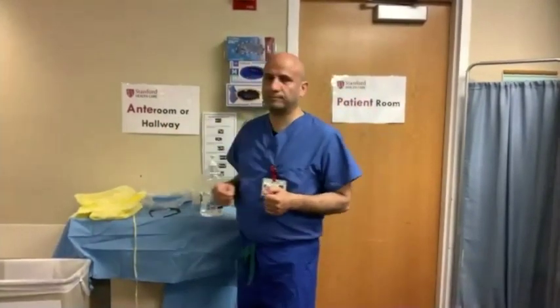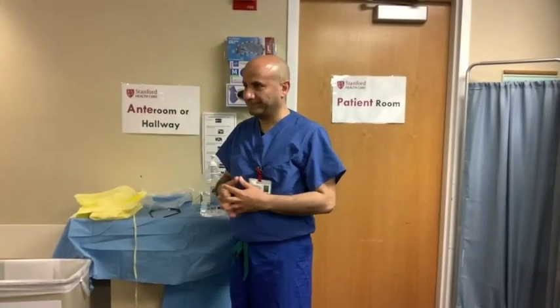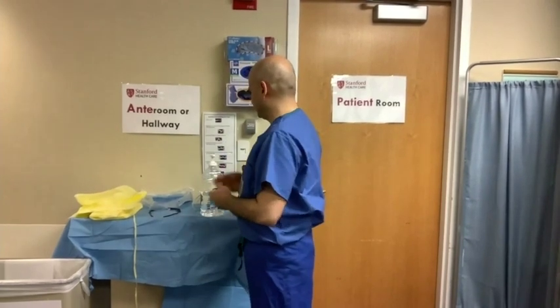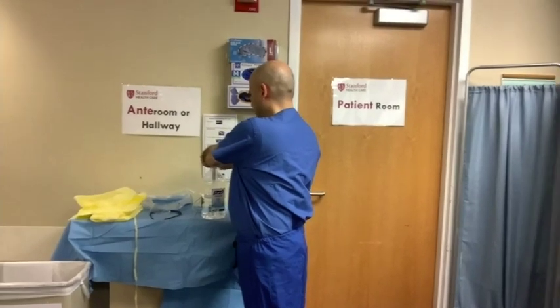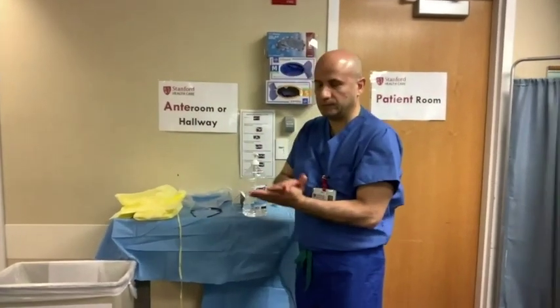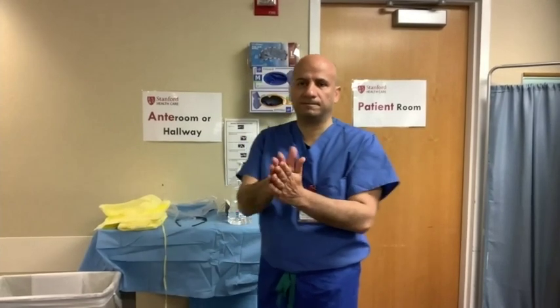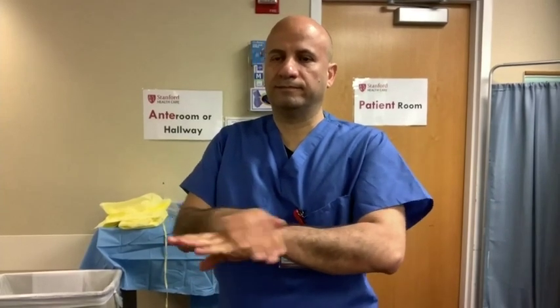The first step would be to tie back your hair if applicable. That's not applicable to Dr. Nassar, but we'll move right along to sanitizing and washing your hands. Perform hand hygiene for approximately 20 to 30 seconds. Apply one to two pumps of alcohol-based hand rub to the palms of your dry hands. First, rub palm to palm, then rub one palm over the dorsum of the other hand and vice versa.